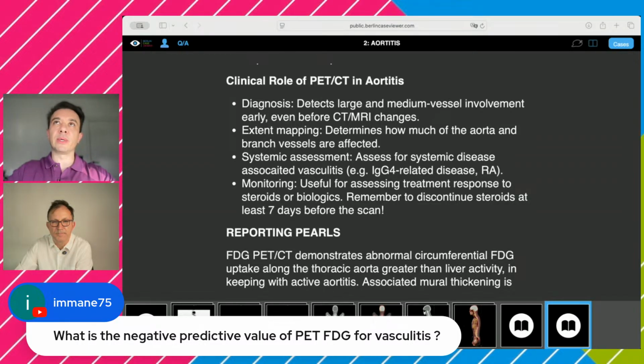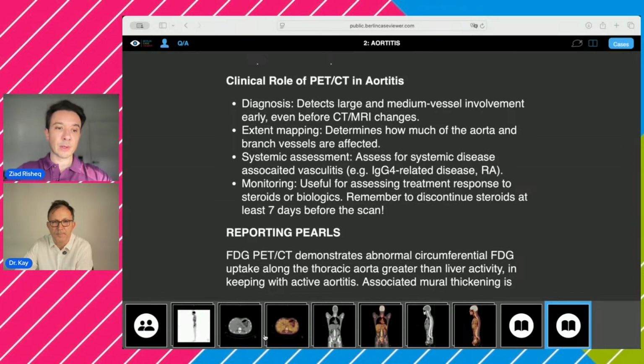Okay, so basically we tell the patients that they should avoid any kind of exercise 24 hours before doing the scan, because it can show a very intense uptake, especially if the patients go to the gym and work out before they come to do the exam. You can end up with a muscular scan. Basically, all of the uptake is within the muscles, so you can't interpret this. You have to do it again. So we tell them to refrain from any kind of exercise for at least 24 hours before the scan. This is a must. You can't avoid this.